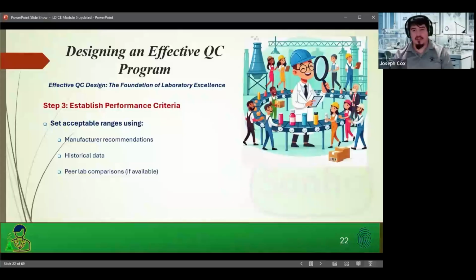Let's say glucose tests out at 100. You shouldn't only be evaluating 200. You shouldn't have a QC of 200 and 150 if 100 is normal. The opposite: if 100 is normal, you shouldn't have a QC of 50 and 100, because you're losing your accuracy, your reliability in the high end or the low end, depending. The high end is that last example, with the low end in the previous example. So you don't want to lose ranges. Make sure your range is acceptable, but also that you're monitoring a reasonable chunk for the population.